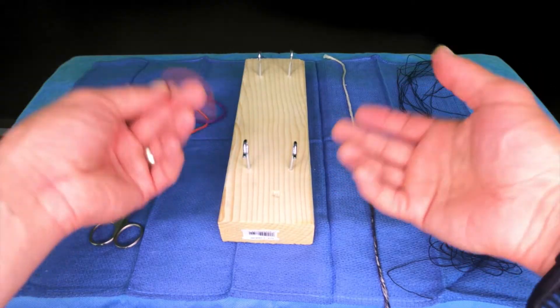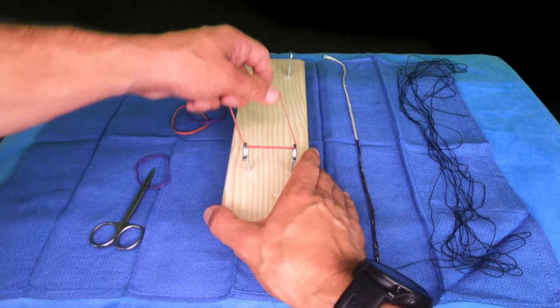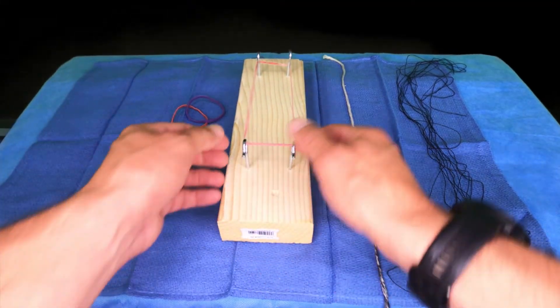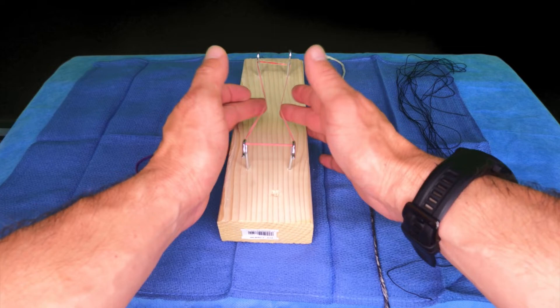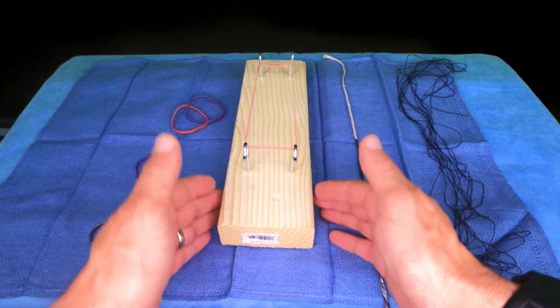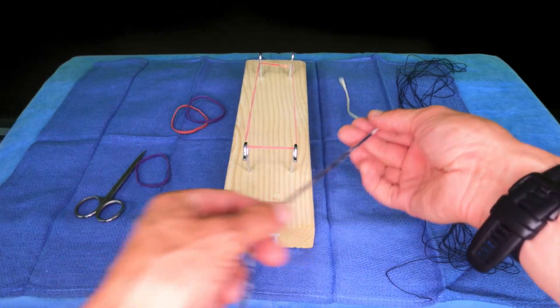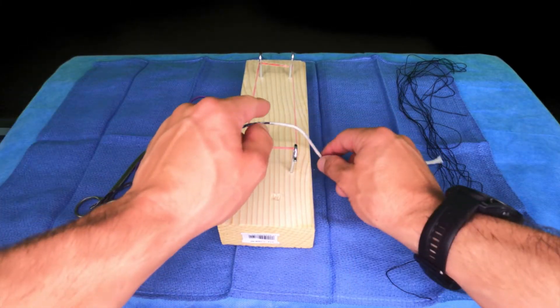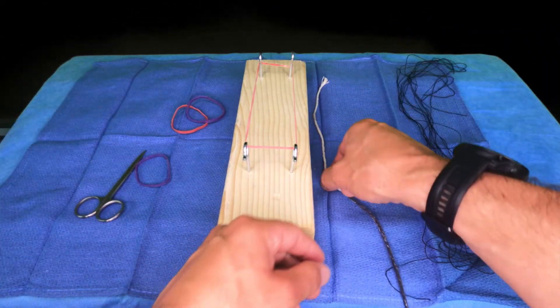These rubber bands you can get at any supermarket. We put that under a little bit of tension, and now that's going to give us some tension to tie against — that's really important. I also have a pair of scissors, and I have a string. I colored one half black so you could see it; the other is left white.